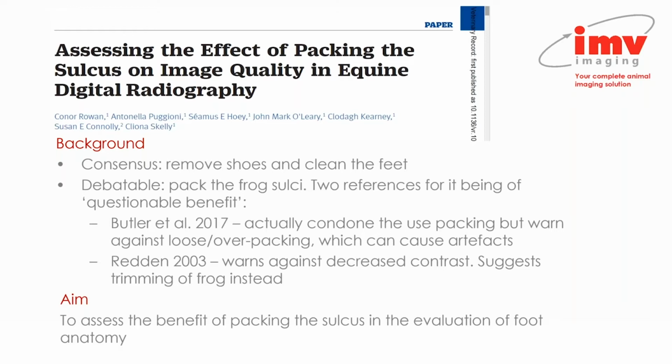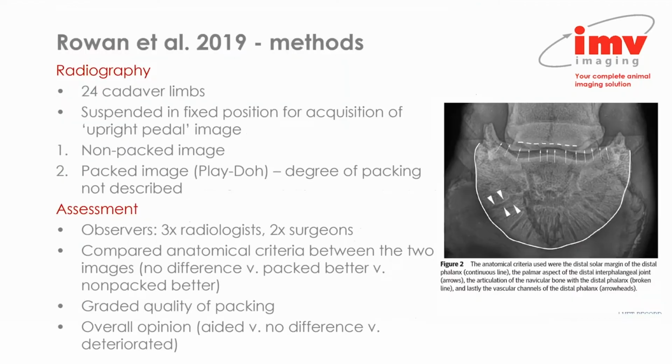So coming back to this study, the aim was to assess the benefit of packing the sulcus in the evaluation of foot anatomy. So they acquired 24 cadaver limbs and they suspended these limbs in a fixed position for the acquisition of an upright pedal image.